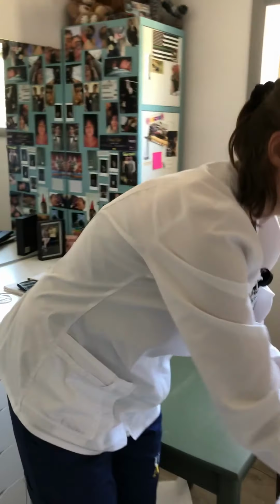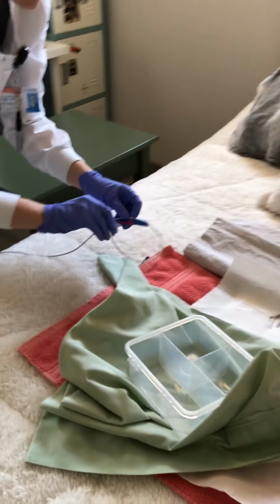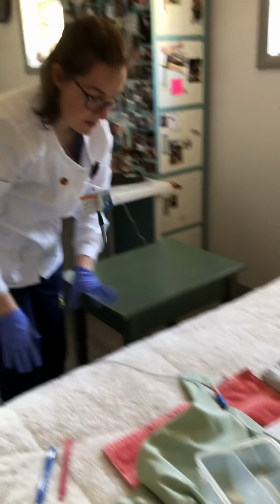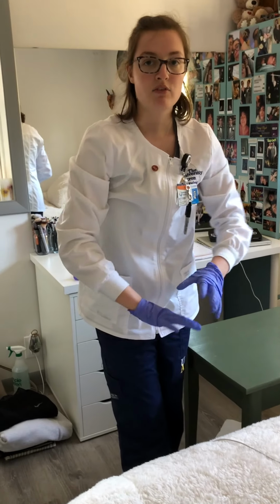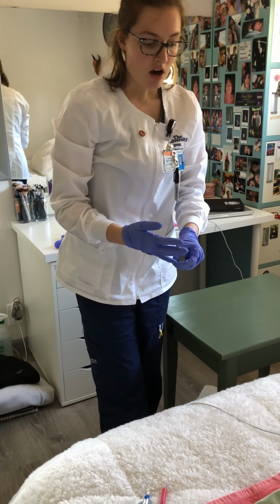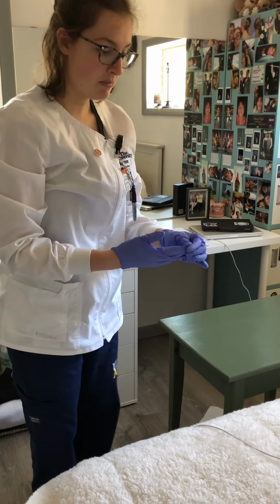I'm going to make sure that there are no kinks in the catheter, and if the patient has other tubing, that nothing's intertwined, that everything is kind of in its own space. And then I would take off my gloves and just clean up a little bit.